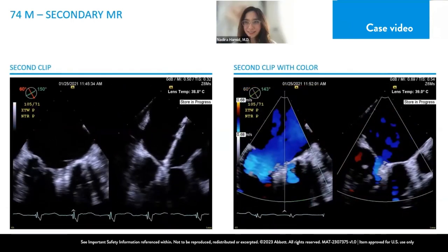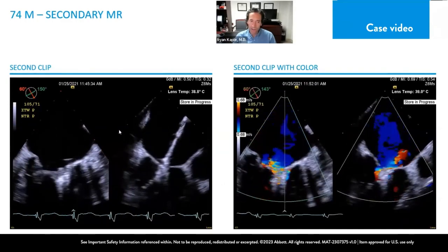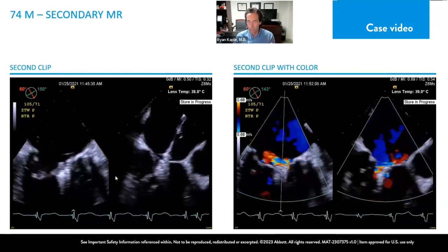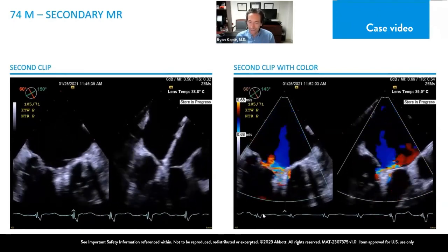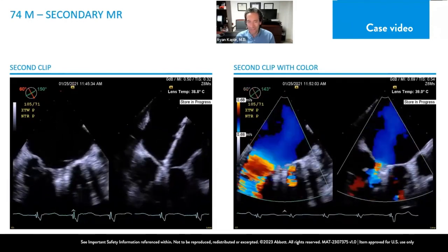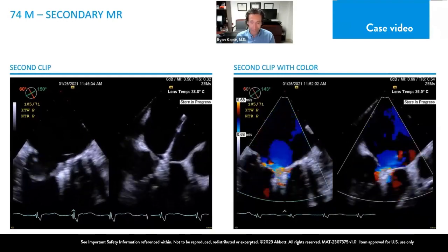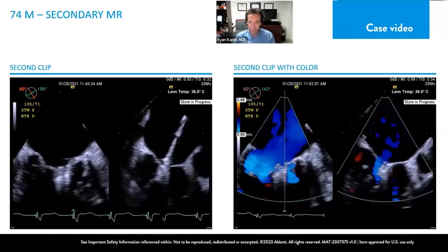react. Yeah. So thankfully, we were able to, with a very careful alignment of the trajectory, come in and get lateral to that first clip. I think in these circumstances, we sometimes say it's a one-way trip. If you're going into an area that small, it's going to be hard to come back into the ventricle.